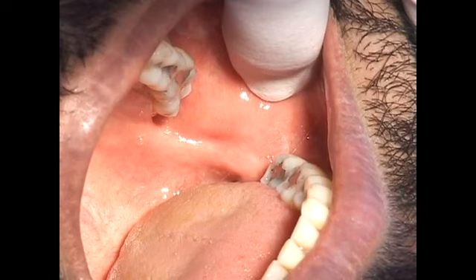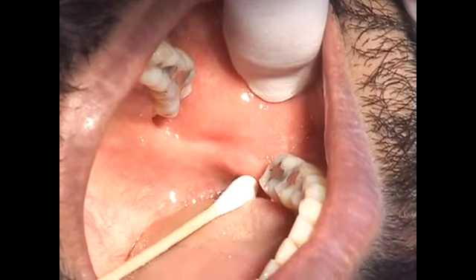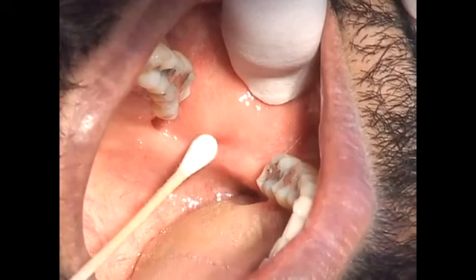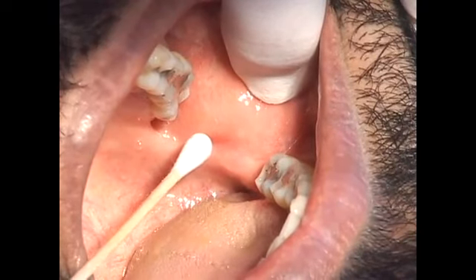Request the client to open their mouth as wide as possible. Firmly retract the cheek with the thumb or index finger on the coronoid notch. This facilitates identifying the raphe, which is a band of tissue that begins just behind the last maxillary molar in an arc and terminates in the retromolar pad distal to the last mandibular molar.